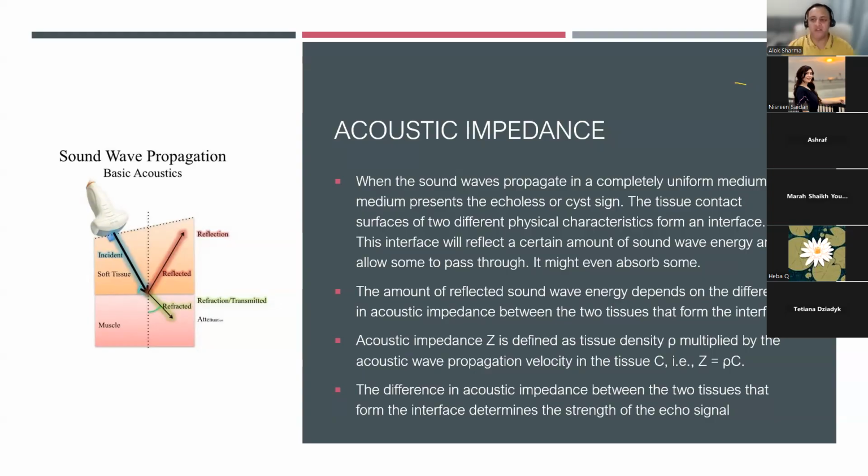This also applies to the lung. Assuming that from my perspective this is lung, then the pleura superficially is quite dense, and then you suddenly have alveoli which are filled with air. So there is a difference in the density with which sound waves will move between air and the pleura, and the higher this difference in density, the more the reflection back.